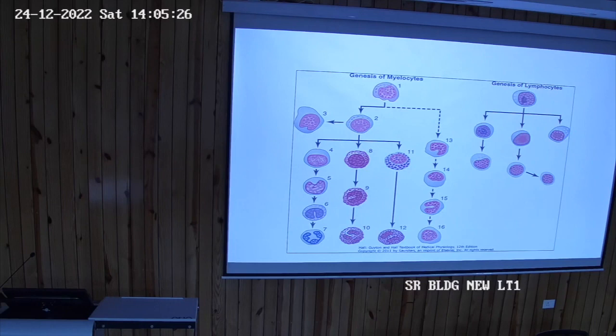Okay, when you see a blood film or a smear and focus it, the maximum number of cells which we see under the microscope is RBC. The size of RBC is 7.2 micron, because the number of RBCs runs in millions. So when we get a field, meaning the thing which we have focused on the microscope, in that particular field you will be able to see 2 or 3 rare WBCs out of 500 RBCs.